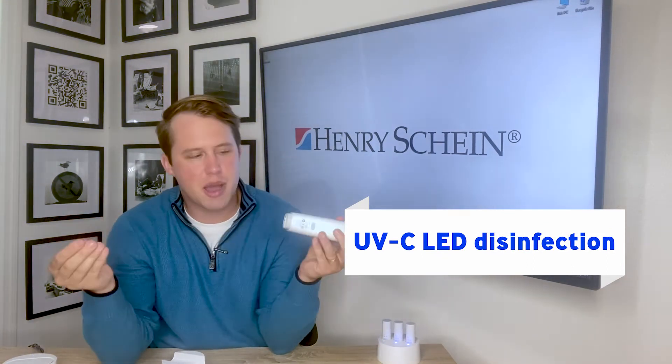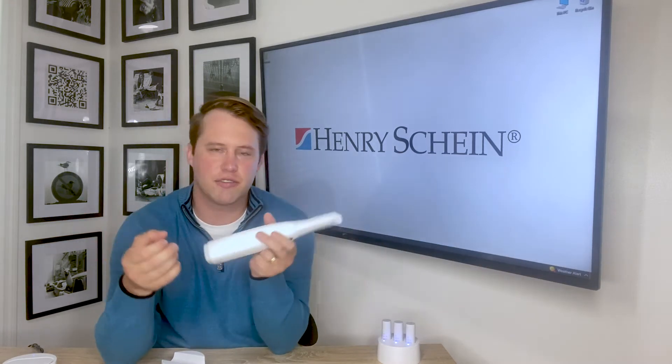And most obviously, there's no power cable. This thing is fully wireless — it's like a dog off its leash.